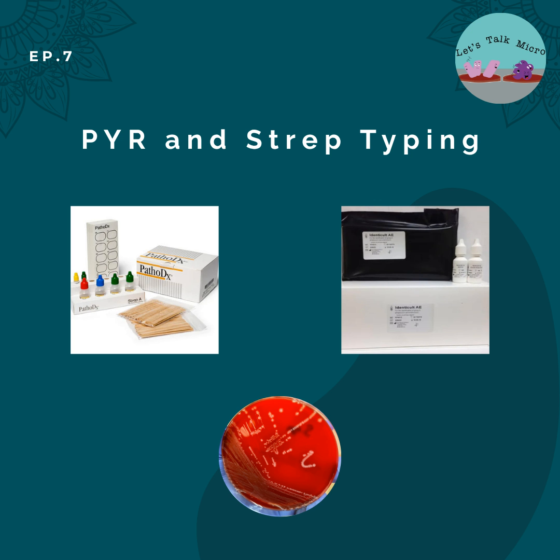So every week we do a recap. I'm going to do it briefly. We have a lot to talk about today. So last week we talked about catalase and we talked about coagulase, right? So what is catalase? Catalase is an enzyme that basically catalyzes the release of water and oxygen from hydrogen peroxide. And staph has this enzyme. So this is the first test that we do when we have a gram-positive cocci. We do a gram stain. And then you have clusters, right? You do a catalase, it's positive. So then you will do the coagulase.